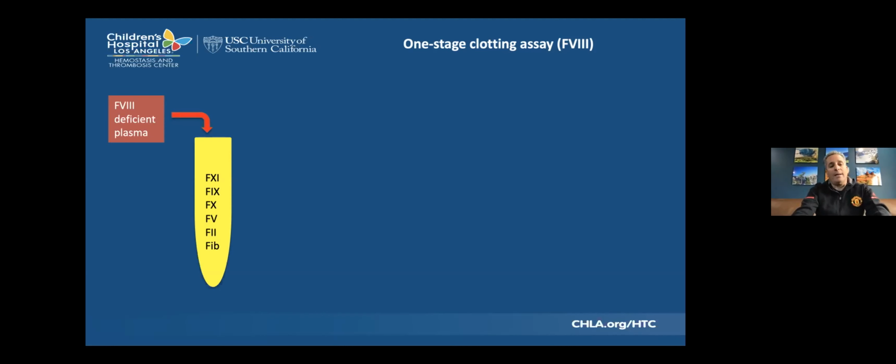So you're adding to this sample plasma that is deficient in factor VIII and basically isolating out that plasma has all the other coagulation proteins. So it's going to give you a normal PTT other than the lack of factor VIII. So the patient sample must supply the factor VIII. The rest is the same: activator, phospholipid, calcium, you run, and the coagulometer is actually running a PTT.